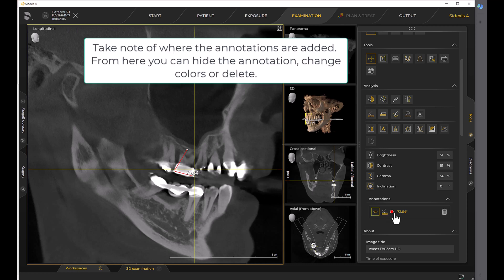Take note of where the annotations are added. From here you can hide the annotation, change colors or delete.